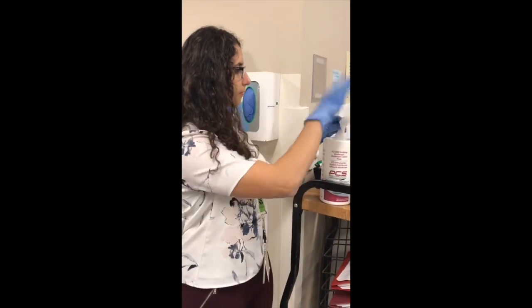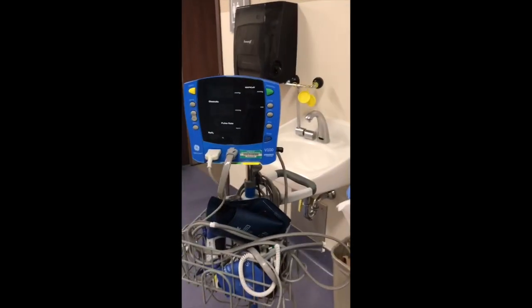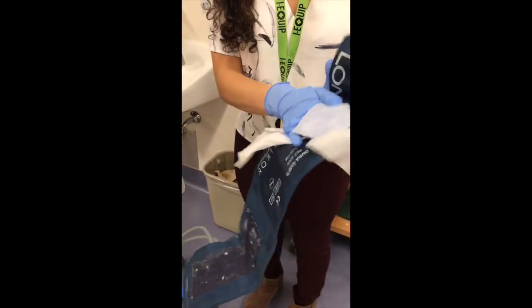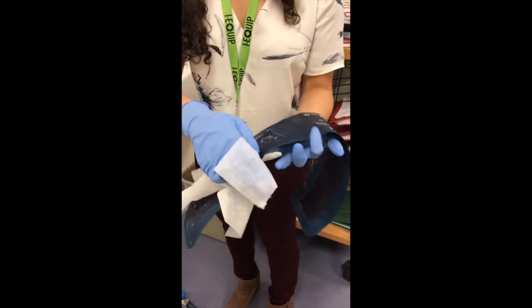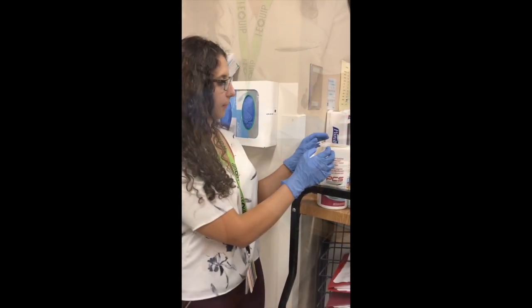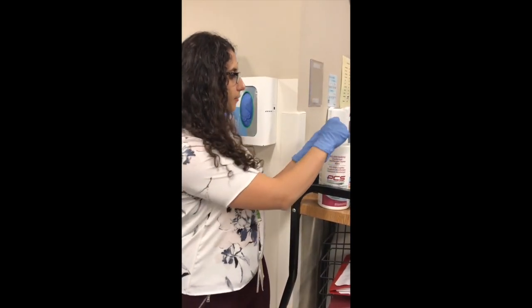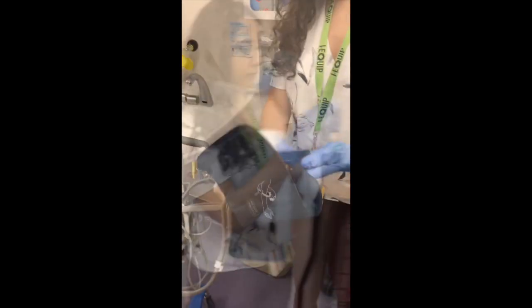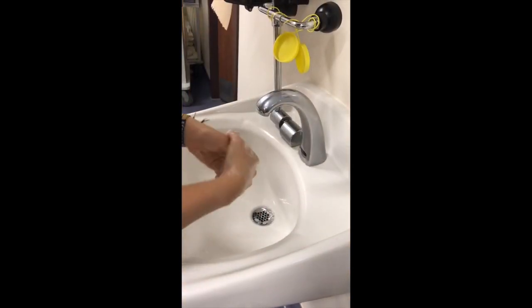Before entering the patient room and putting on gloves, be sure to perform hand hygiene. After performing hand hygiene and putting on gloves, take a PCS 5000 wipe and applying pressure, clean the inside and tubing of the blood pressure cuff. Next, taking another PCS 5000 wipe, use it to clean the outside surface of the blood pressure cuff. When finished, be sure to dispose of gloves and perform hand hygiene.